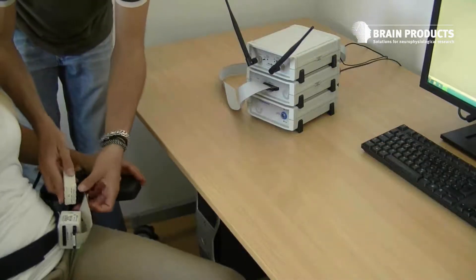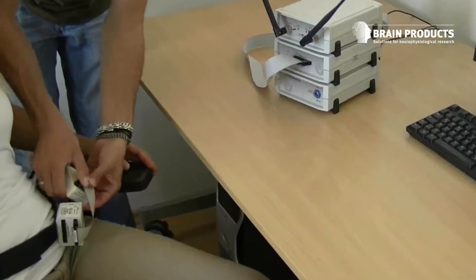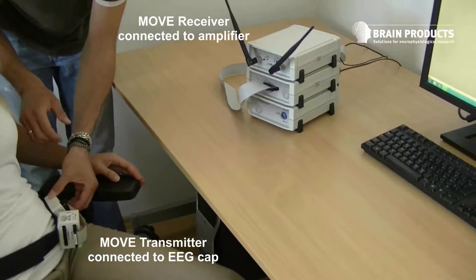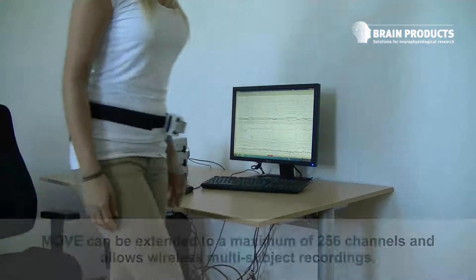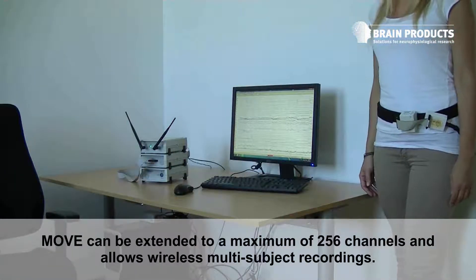Digital data transmission between transmitter and receiver starts immediately, and you may continue with your study right away. You're now wireless — ready to move. MOVE can be extended to a maximum of 256 channels and allows wireless multi-subject recordings.